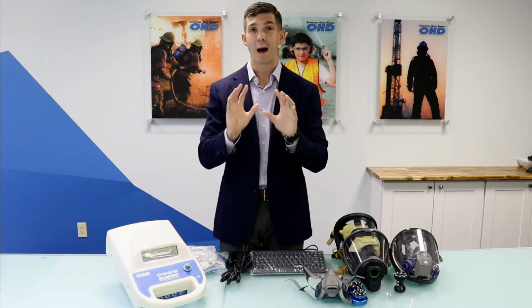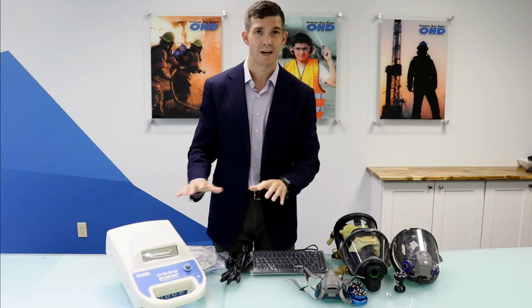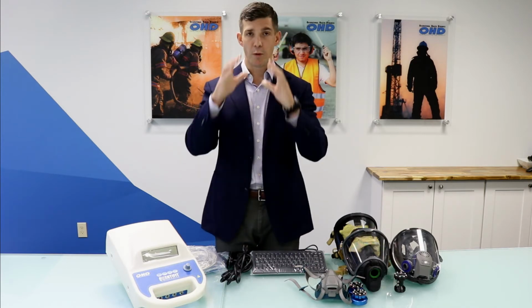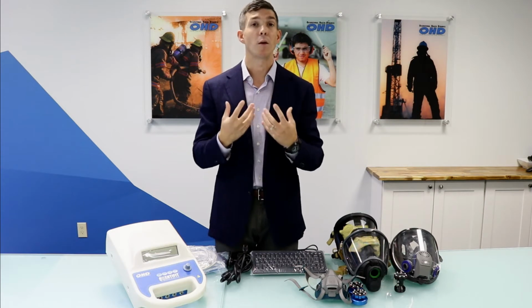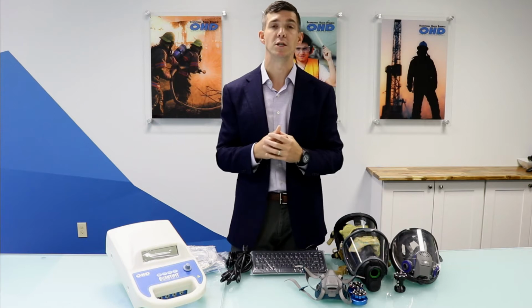So I want to quickly highlight those protocol steps for you now before we get further into setup and things like that. So those steps are a face forward step where the person will don the respirator, they'll take a breath and hold it, the machine will pull that heavy work rate and look for air leakage into the mask.